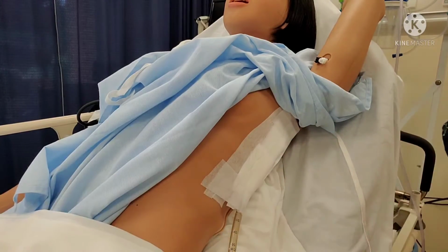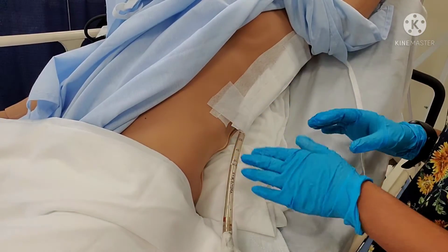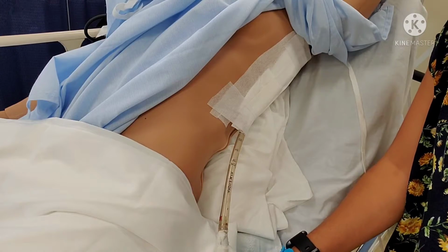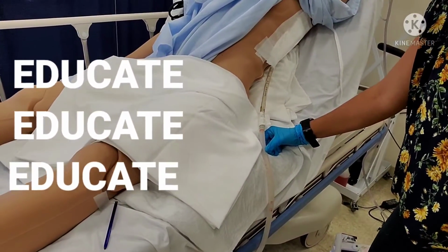Moving down, I'm going to want to look at my tubing. Now, I should be educating my patient about this, okay? If you notice the dressing is coming off, or if the tubing is kinked, please call me. This tubing is very thick and very long, and it can get tangled very easily, okay?